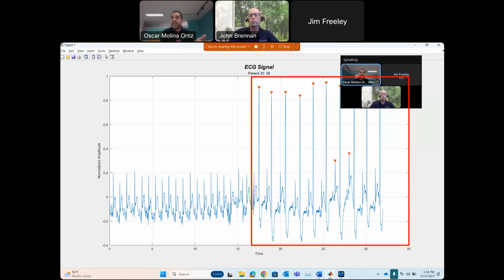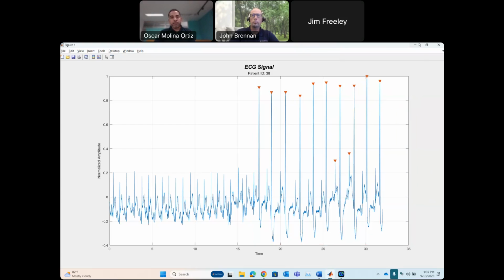So this is actually telling us that we also need to be very careful with the data that we pass through these algorithms, and MATLAB Test is upfront, very quickly helping us to detect this type of potential errors when it comes to application deployment.